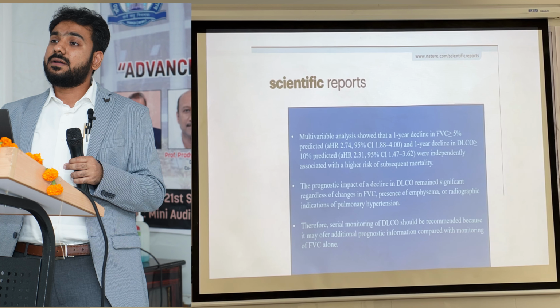What they summarized was that the multivariate analysis showed that a 1 year decline of FVC more than 5% predicted and a 1 year decline in DLCO more than 10% predicted were independently associated with high risk of subsequent mortality. The prognostic impact of decline in DLCO remained significant regardless of changes in FVC, presence of emphysema, or radiographic indications of pulmonary hypertension. Therefore, serial monitoring of DLCO should be recommended because it may offer additional prognostic information compared with monitoring of FVC alone. Okay, this is in ILD.